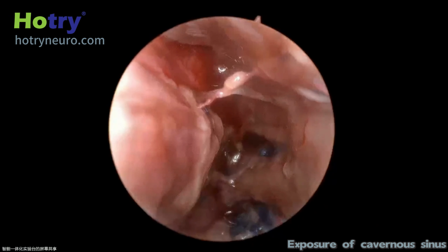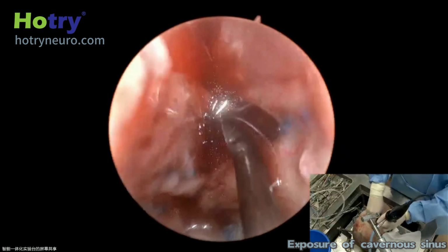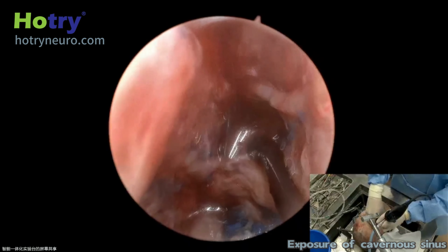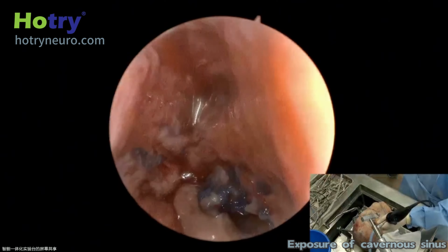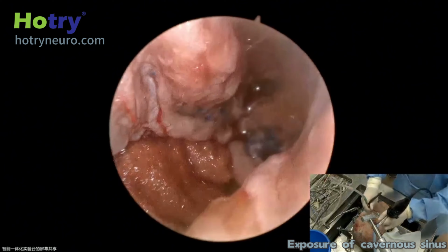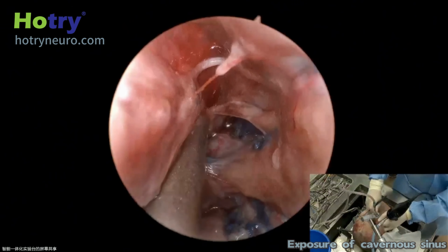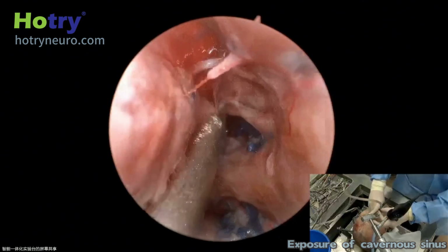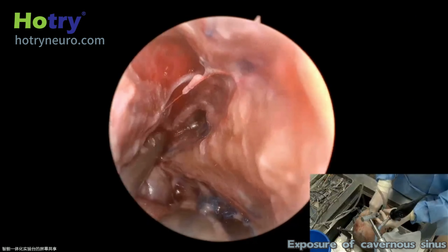Now we want to do the approach to the cavernous sinus. So this would be the triangle that we want to go in, between the fourth and the V1. So what triangle is this? It's Parkinson's triangle. You see the blue dye inside, that is within the cavernous sinus.